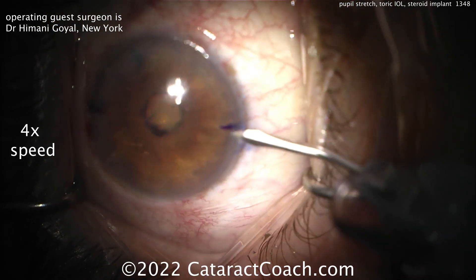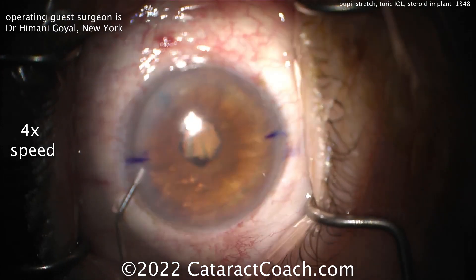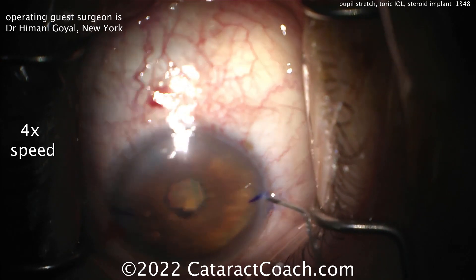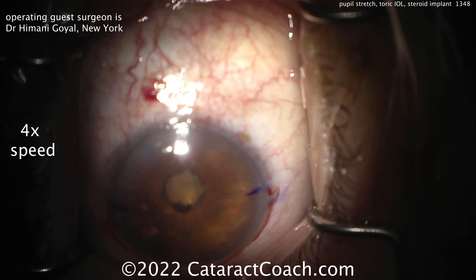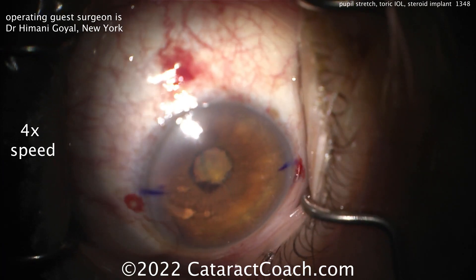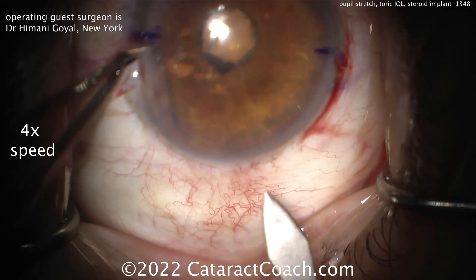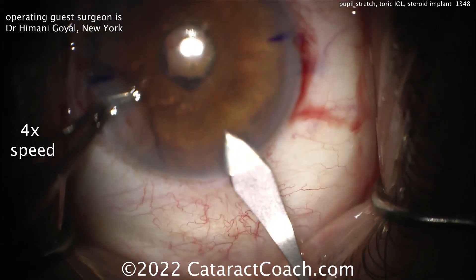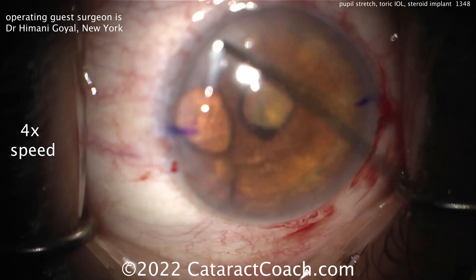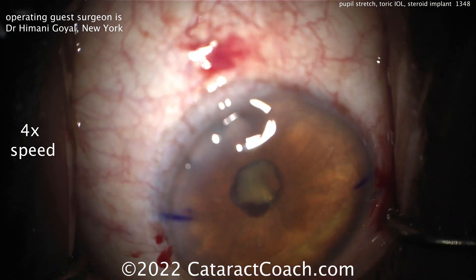We're looking at an eye that has a small sneaked-down pupil. You see some toric marks made there. Two paracenteses made 180 degrees opposite each other. Now we sped up the video. Here comes the main incision — that looks like a good tunnel length. And now some viscoelastic on the surface of the eye just to get better visualization.